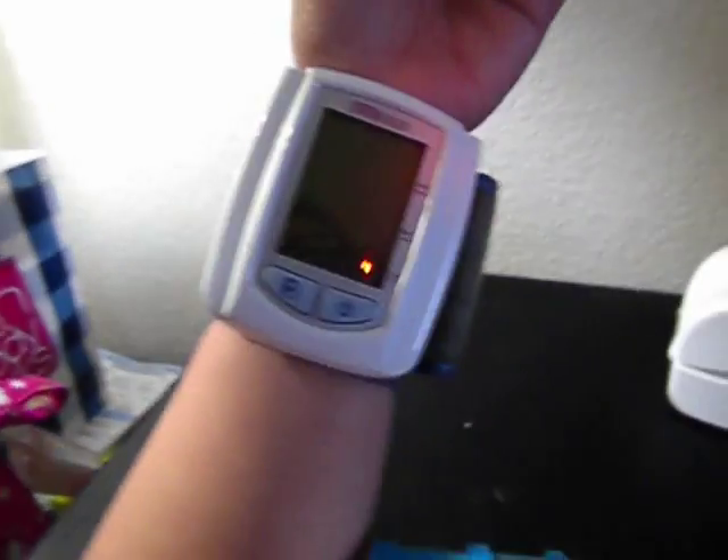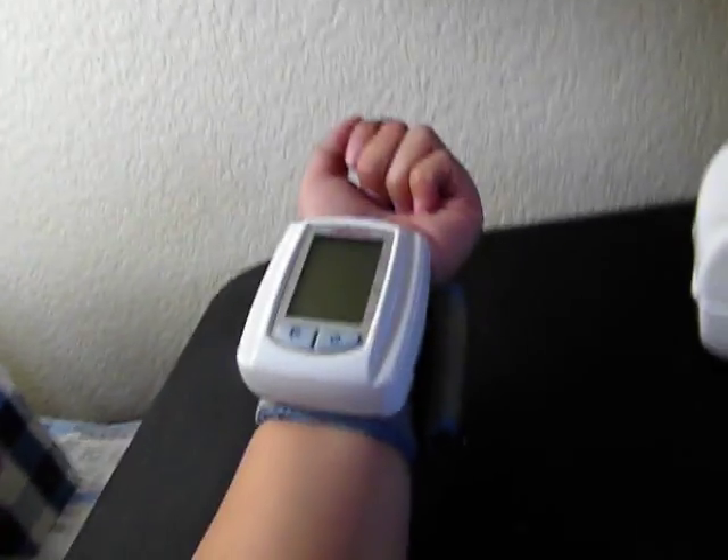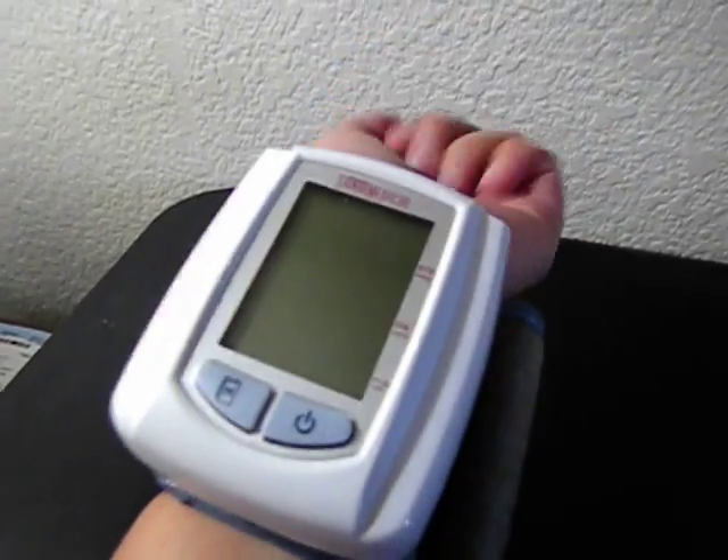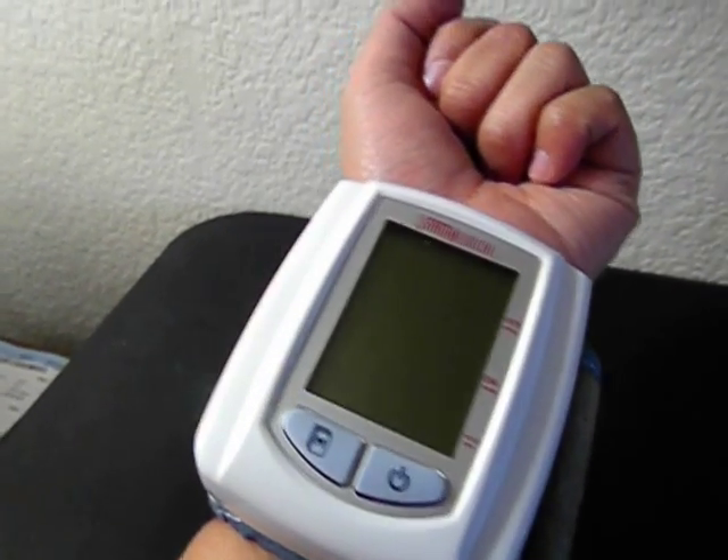So the thing here is, if you're going to take your blood pressure, don't lay your arm down or have it super up. You just have to do it at a level angle where your wrist is at the level of your heart.